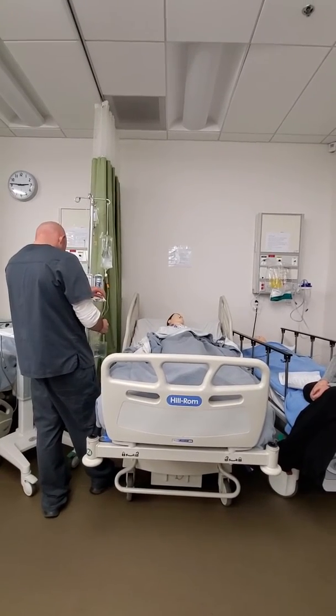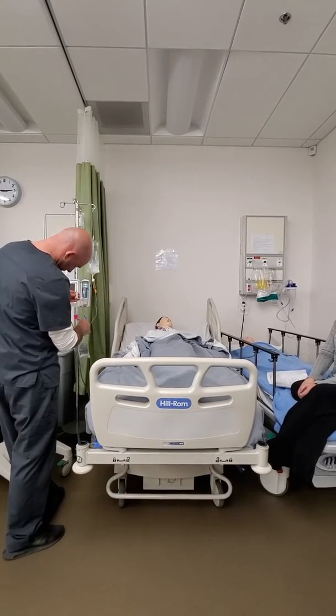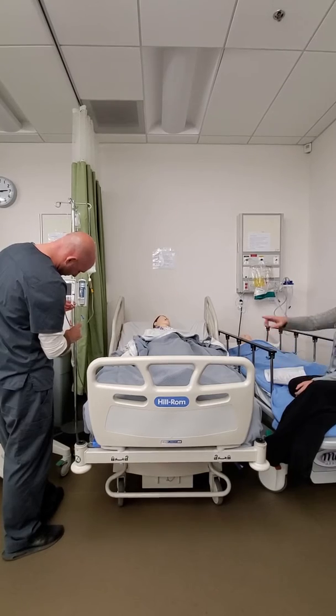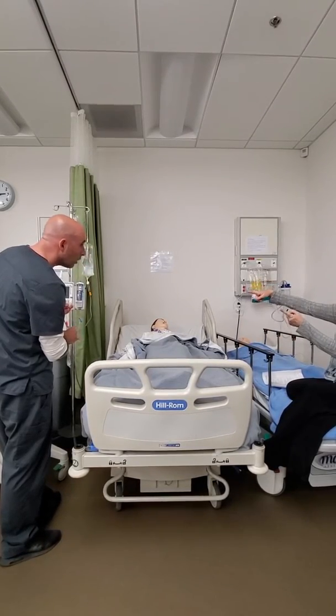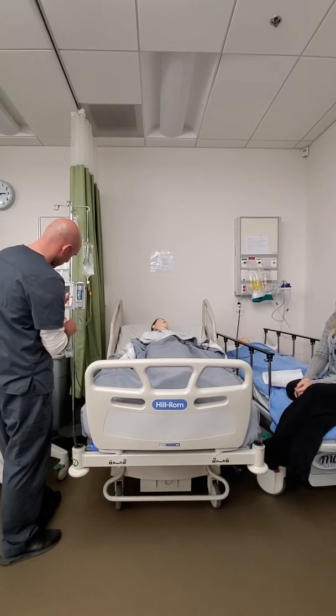I'll do this. And that's plenty. You really just need a line of fluid across the bottom of the bag. It's only 10 milliliters that you're washing out on that secondary. Okay. So it doesn't take a whole lot more than that.